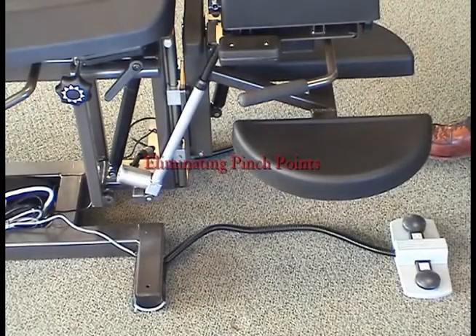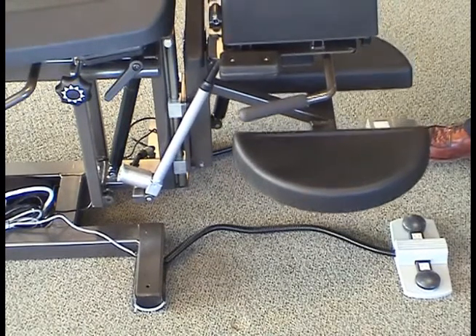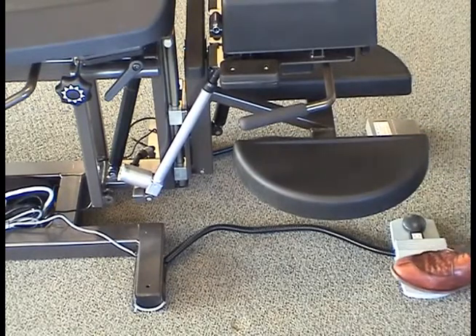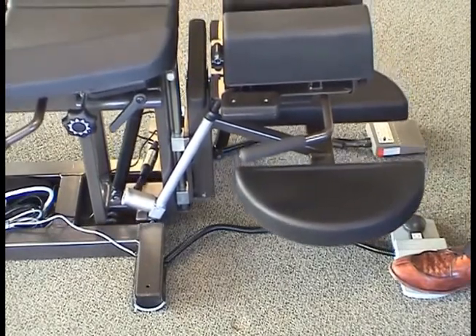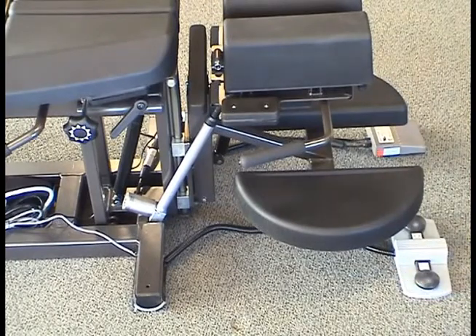PCT has attempted to eliminate or reduce as many pinch points as possible. Common sense and caution are expected to be used in any potential pinch point areas of the table, including under any of the pads, under the electric elevating headpiece, and under the moving carriage of the table that is equipped with the electric elevation motor.